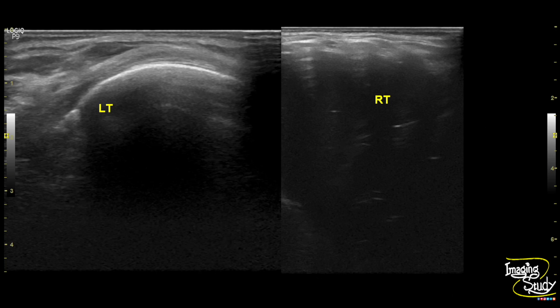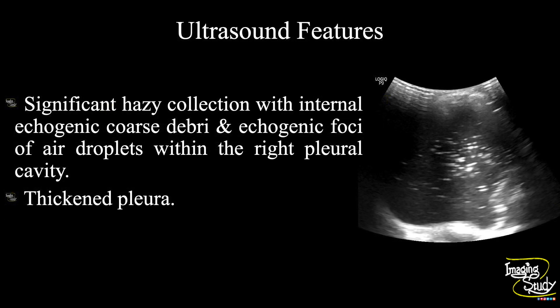This indicates the fluid is situated within the two layers of pleura. In summary, a significant hazy collection with internal echogenic coarse debris and echogenic foci of air droplets are seen within the right pleural cavity. The pleura appears thickened. So the diagnosis is pleural empyema.